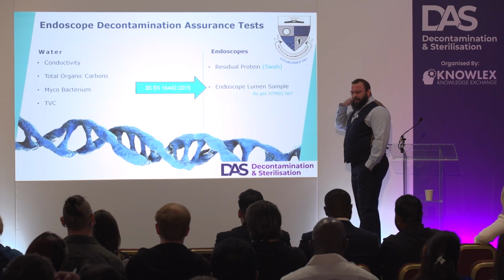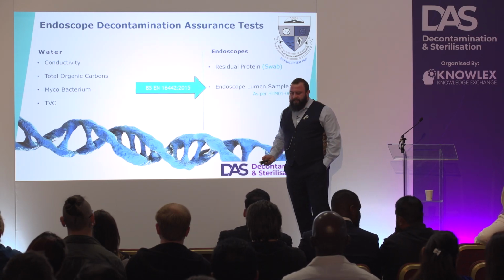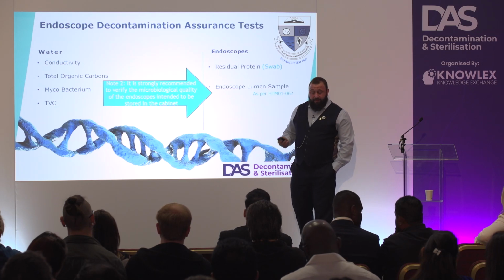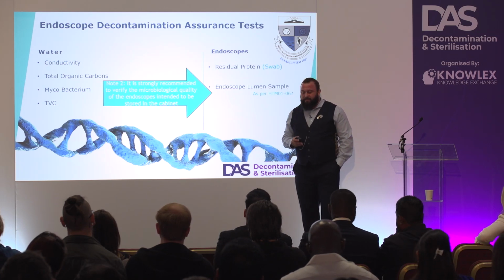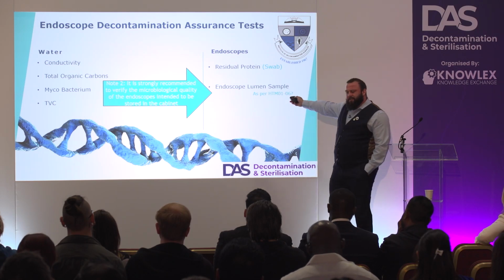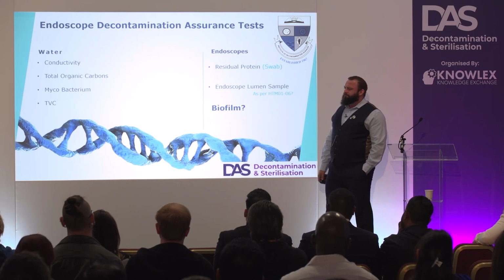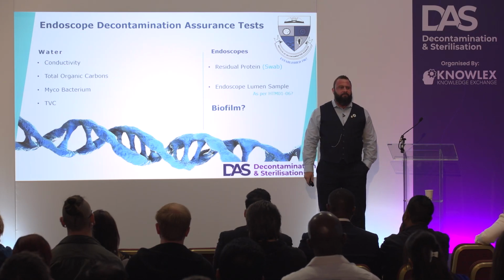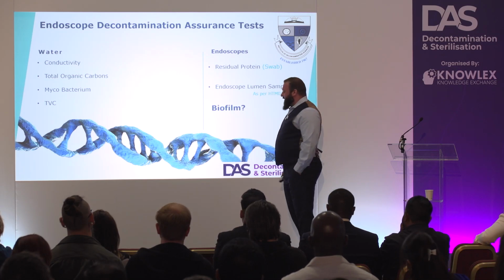When we look at BS EN 16442, which is the standard for dry storage cabinets, it's strongly recommended that the microbiological quality of the endoscope intended to be stored in the cabinet is tested. So that would be a suitable test to comply with that. But what about biofilm? If we're not doing the lumen test, we're not going to be testing for biofilm, are we?